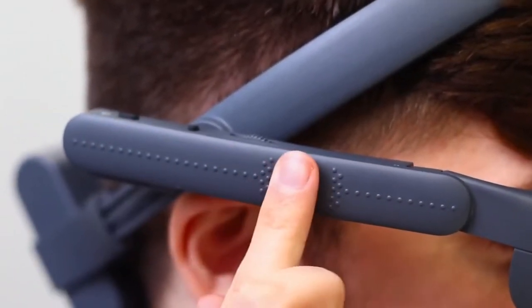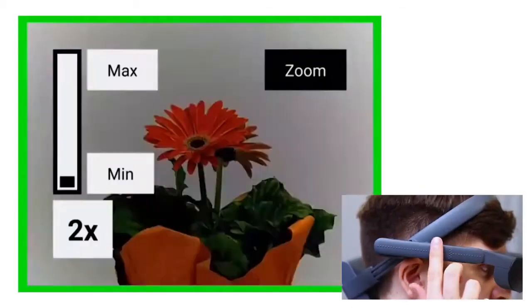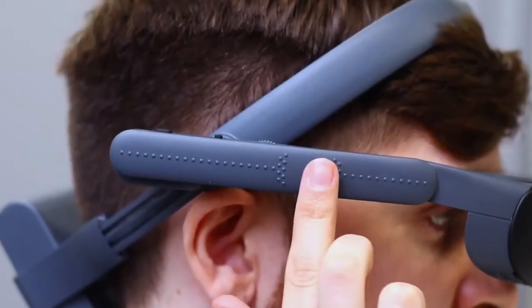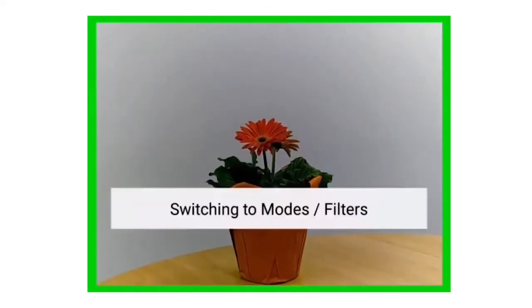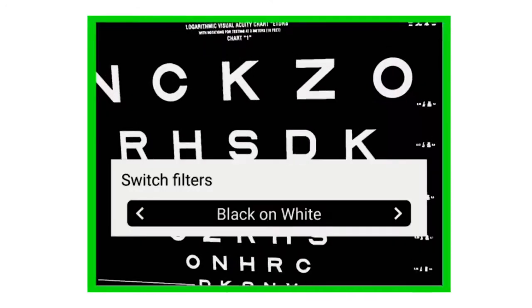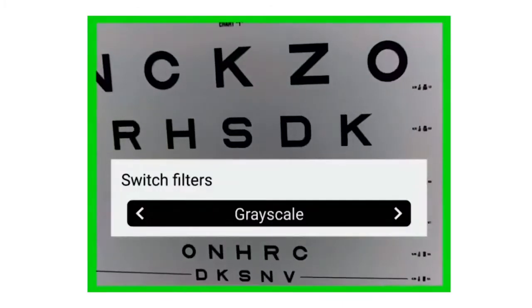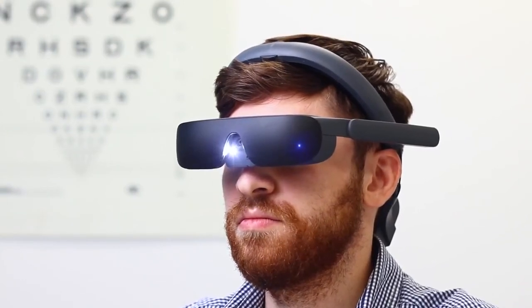Tactile dots provided on the right arm allow the wearer to easily find the touchpad. Using the touchpad, you can see how easy it is to zoom in and out or adjust the contrast. Pressing the context button allows the wearer to access other features. They can change between outdoor, reading, TV, custom, and indoor modes. They can switch filters to the one that offers the best visual acuity for the task at hand. They can even turn on the flashlight, which is useful when out at night or reading in dim lighting.